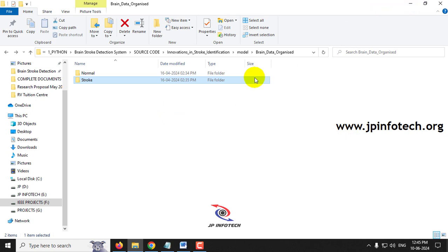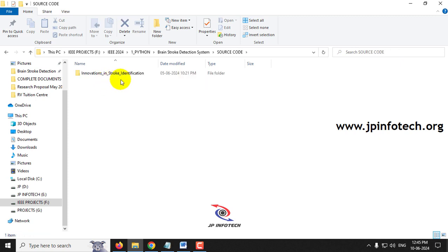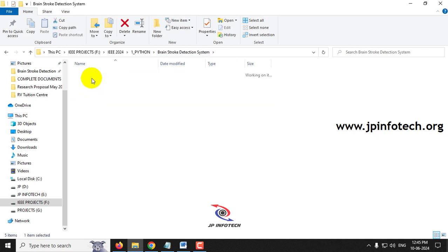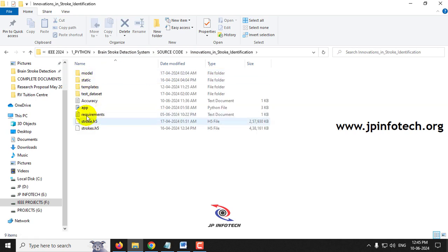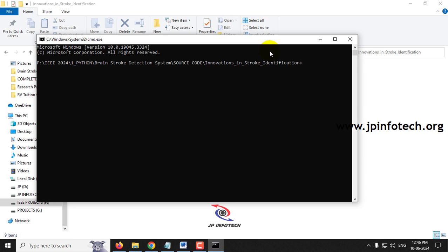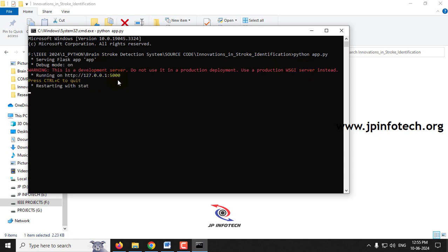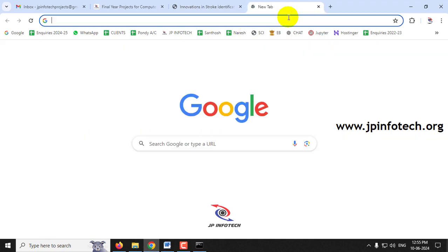Now let's see the execution of the project. Make sure the requirements file is fulfilled — the exact Python version and libraries must be installed. Inside the source code folder 'Innovations in Stroke Identification,' open the app.py file. Type 'cmd' in the address bar to open command prompt at that location, then type 'python app.py' and press Enter. Wait a few minutes, then copy the URL that appears and paste it into Google Chrome.